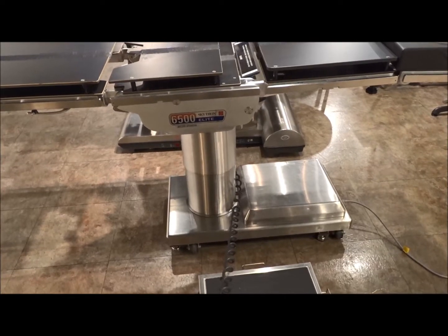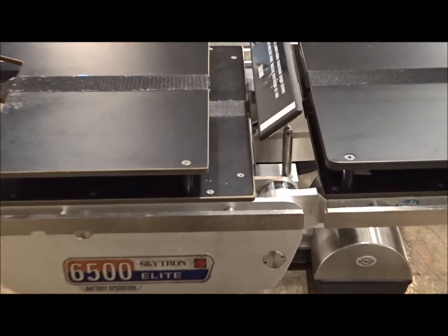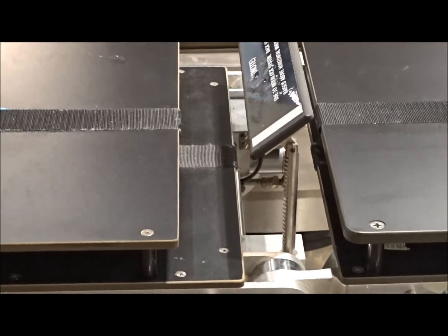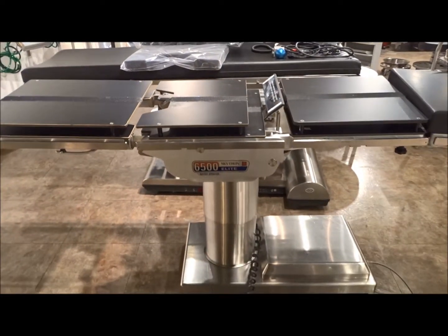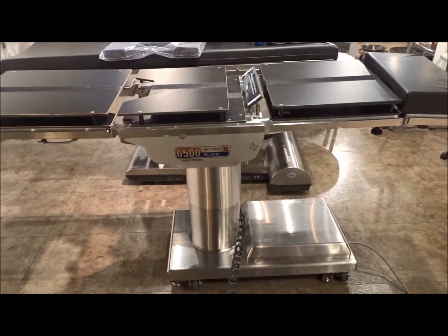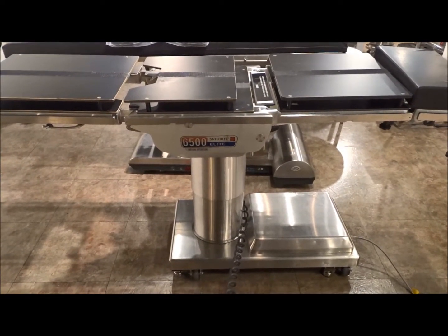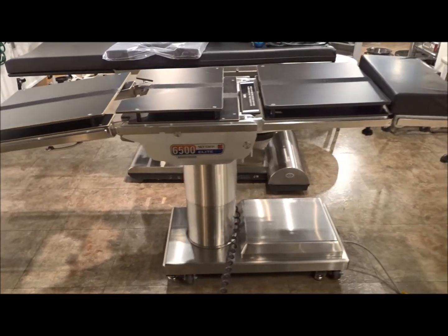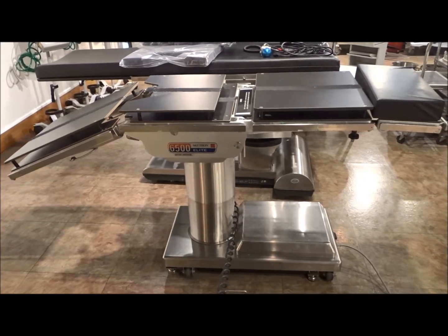It also has the kidney up function, which is going to go up five inches, so you do have that feature there as well. The 6500 is one of the newest in the refurbished used categories, and these can also come with stirrups.